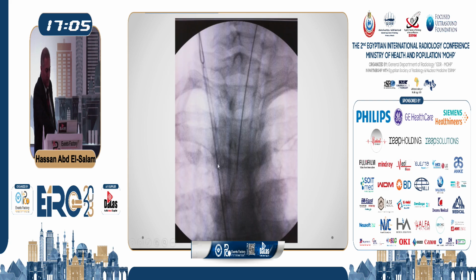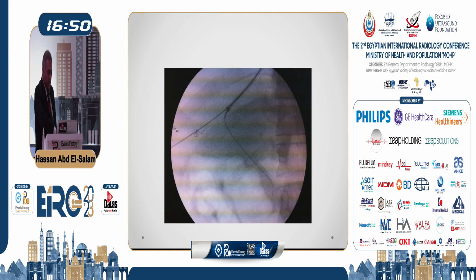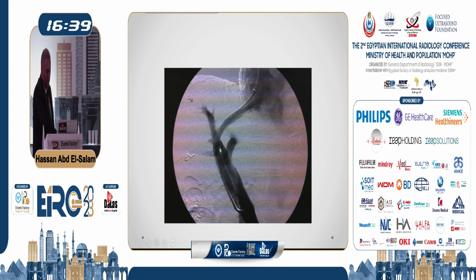So this is the wire being snared into the sheath, into the neck, and then the procedure is completed as a standard TIPS. But the starting part of this procedure is reverse TIPS. So this is after snaring the wire, the catheter is passed through the sheath into the portal vein, and then the procedure continues. This is the stent being deployed between the portal vein and the IVC. So this is a reverse TIPS, and sometimes we coil the tract. This is a coil being introduced in the tract. Sometimes we don't coil the tract.